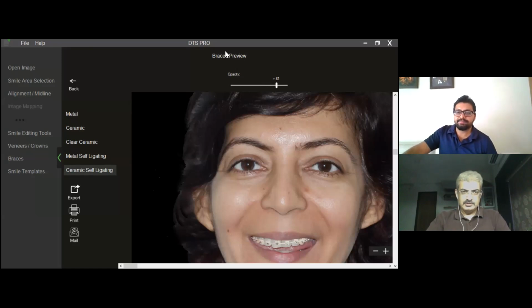Okay. Dr. Anupam Agarwal is asking how predictable the simulations are. It's a subjective thing, an absolutely subjective thing. Unless you get down to measurements on each and every tooth, the primary role for simulation software is still initial patient motivation and case acceptance. Then it depends on our aptitude, and everybody uses a digital platform to a different extent. Somebody would measure each and every tooth digitally, versus somebody who would just use it as an initial patient education tool. So I would say it's subjective.